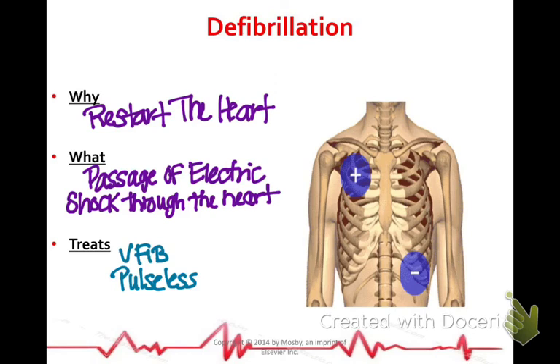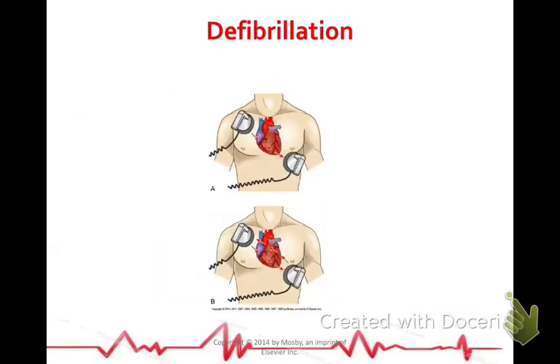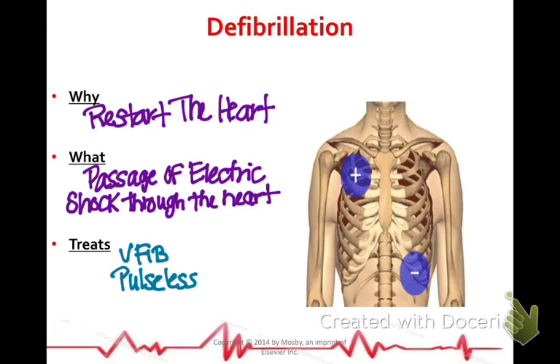It treats VFib and pulseless VTAC. And you see, I have you a nice picture on how you put the pads. I actually requested the crash cart today. We're going to do some.